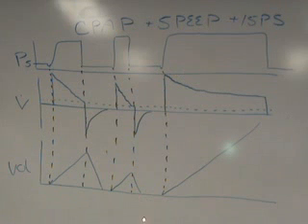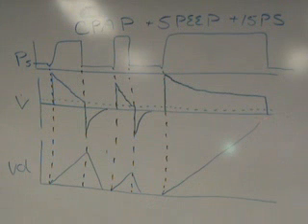Third breath, I only have volume going in, because it's going in and probably leaking out of the circuit. And then when the pressure support limits itself with that time limit, you never see volume coming back out. Therefore, you don't see the volume waveform coming back in.